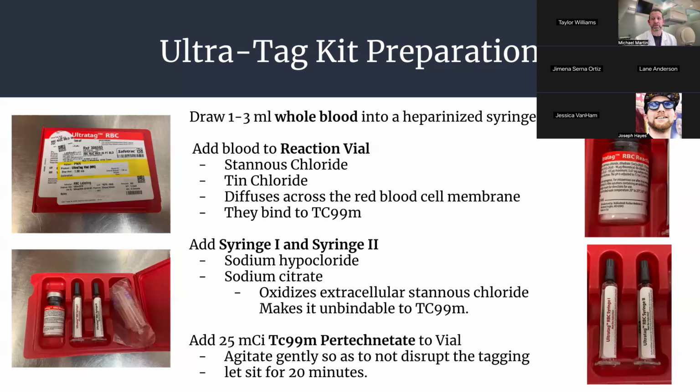But I am going to look into that. It's a good question, because if it could extend the time and give you a little longer, then certainly that's great. I would say as good practice though, anytime you're dealing with blood cells out of the human body, you're always worried about them having issues and breaking apart and things like that. So my feeling is to try to do it according to this protocol. But yeah, I'll look into it. Good question, thanks.